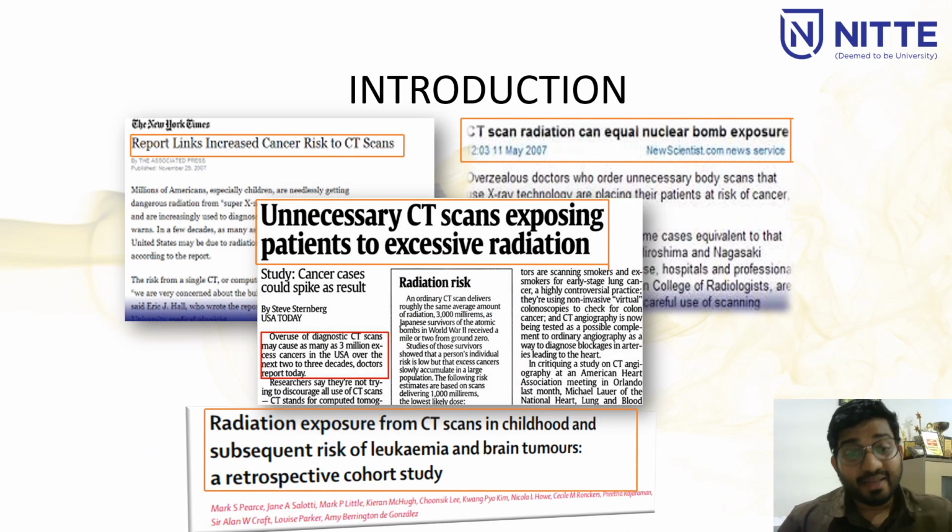In the same way, you can see the paper cuttings here. Unnecessary CT scans exposing patients to excessive radiation, also radiation exposure from CT scans in childhood and subsequent risk of leukemia and brain tumor, a retrospective cohort study. A variety of studies have been happening in recent years about the radiation risk involved in CT scans.